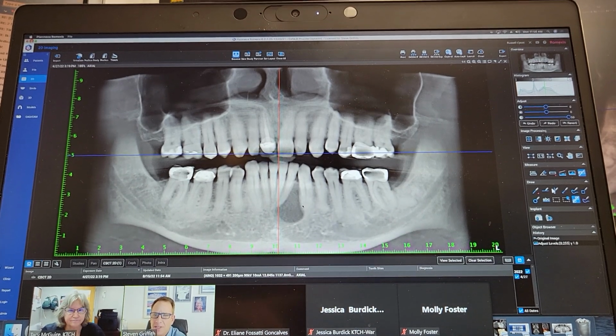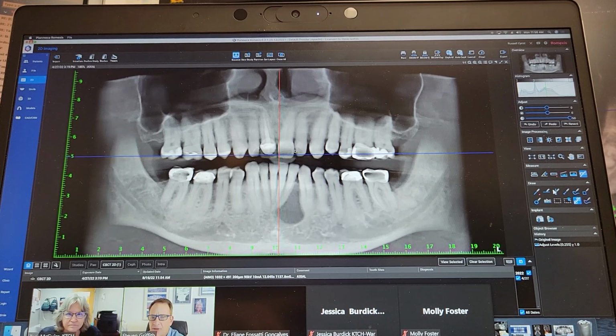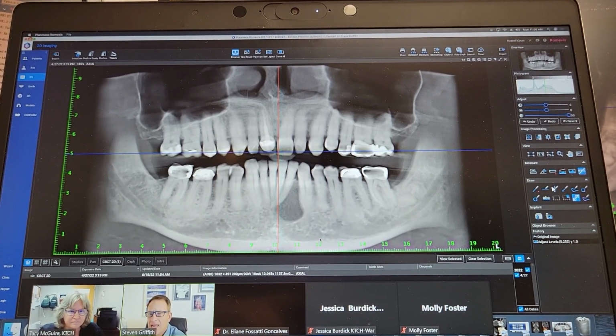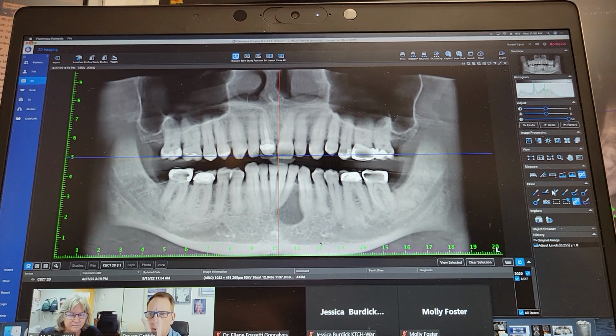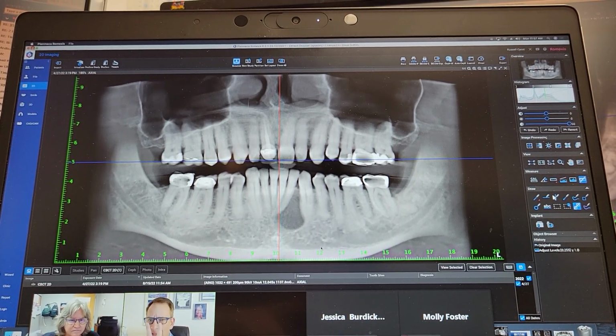And knowing that you can take these 3D for a very tiny dose, like this image here, if I wanted to do just the mandible, I could have taken it for 20 microsieverts. Folks, 20 microsieverts is equal to 2 DEXIS PAs, or 2 of your phosphorus plate images.